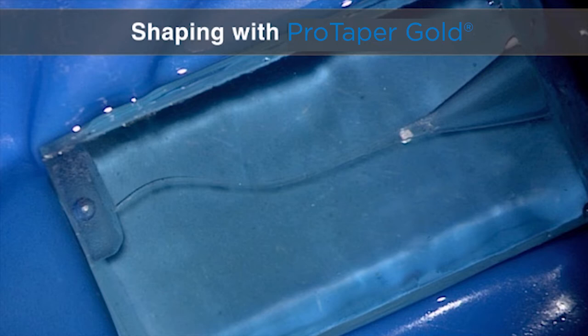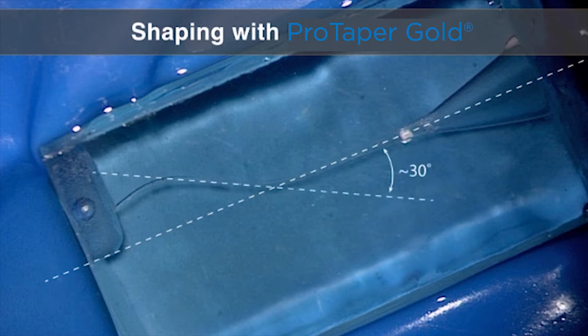Let's take a closer look at what the challenge is. If we draw a tangential line to the first curve relative to the straightaway portion of the canal, you can see it forms an angle of about 30 degrees. And if we draw a tangential line to the second curve relative to the first curve, you can see that that's about 35 degrees of recurvature. So it's a good little challenge.